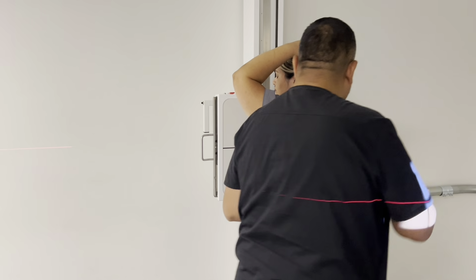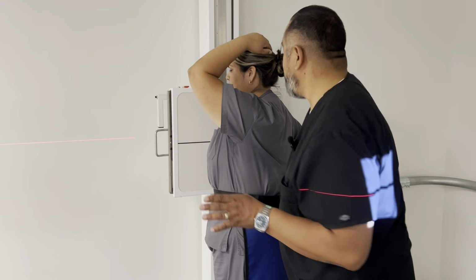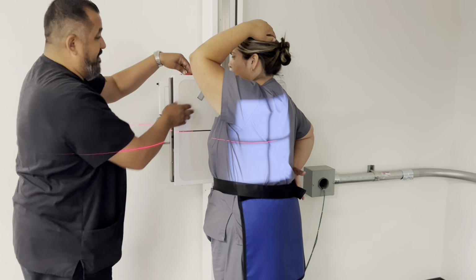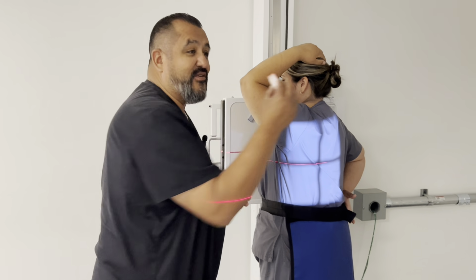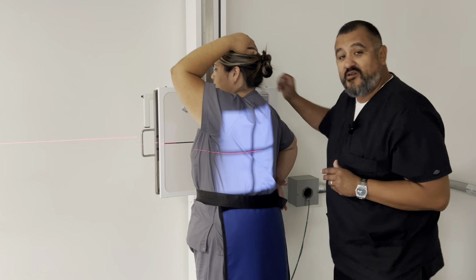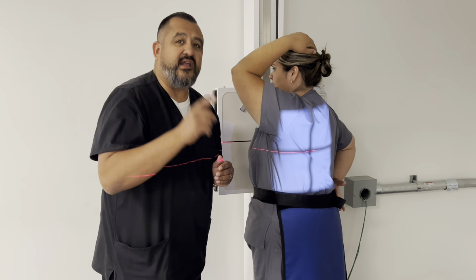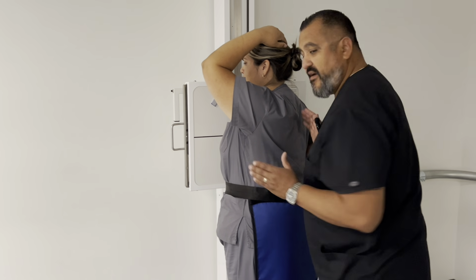So this is a right anterior oblique position. I have her turned 45 degrees. I have my left marker here, all right? I'm going to put this left marker here, and for those people that are strictly by the book, I'll put the right marker down on the other side, okay? Because I know that the side that's down, that's the side that the marker's supposed to be down. But the side of interest, guess what? You're doing an RAO, you're doing it for the left lung, okay?